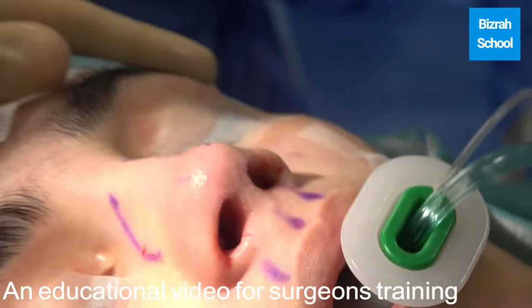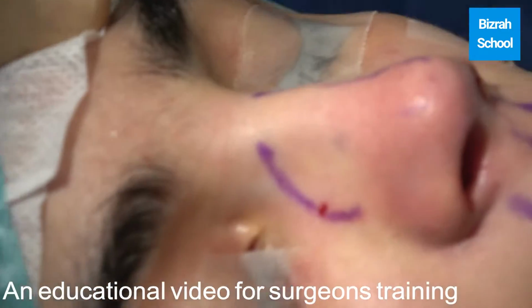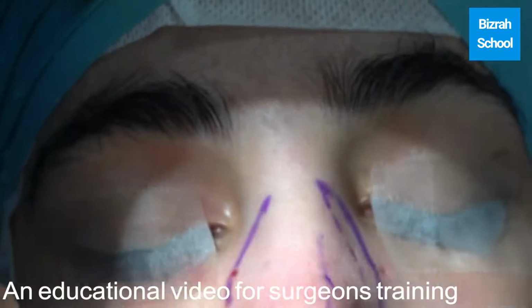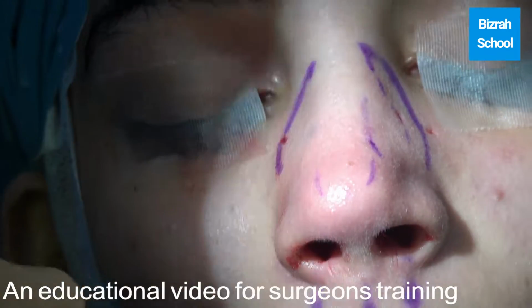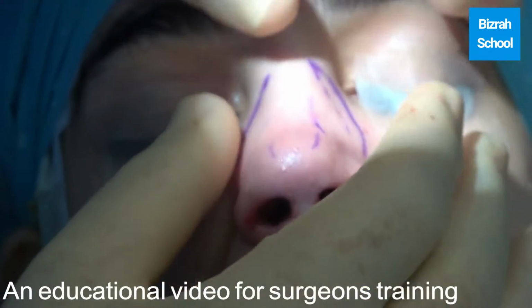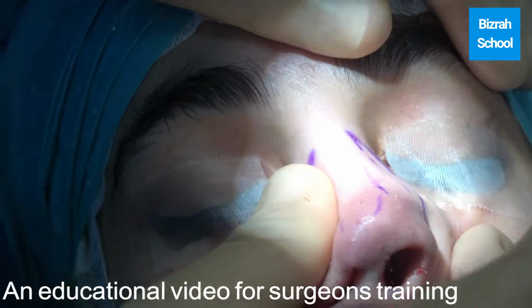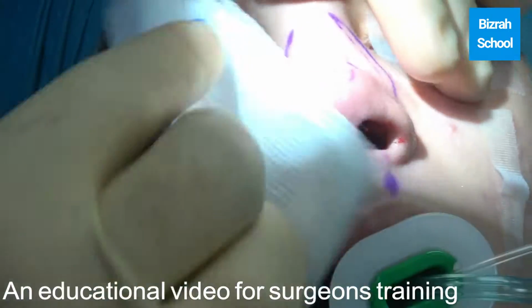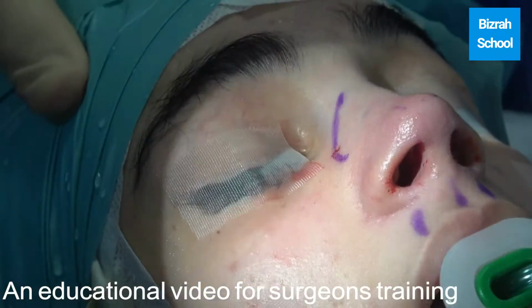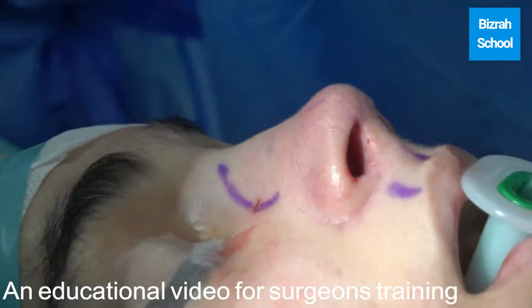You see now a very straight nose, very nice tip elevation, tip projection, tip definition, tip refinement, nostril symmetry, and very straight dorsum. So we have done septoplasty, correction of right caudal dislocation. We did tipplasty, we did left spreader graft, and osteotomy. As you see, it's a very big change, very big difference, very nice profile again.